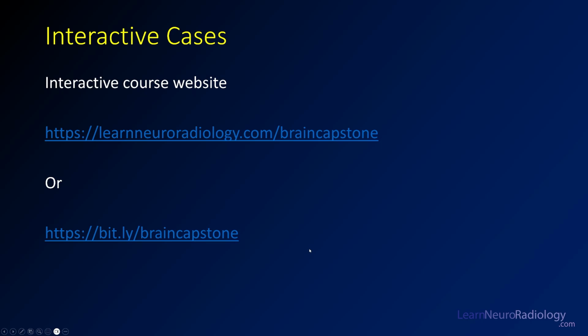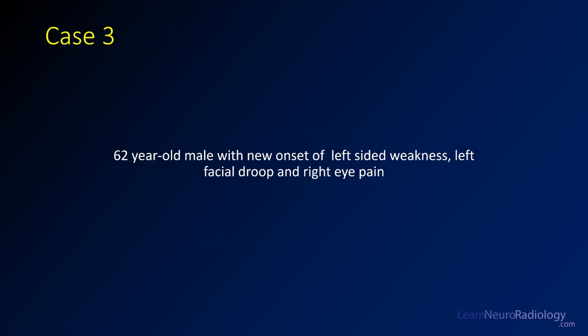So case 3 is a 62-year-old man with new onset left side weakness, left facial droop, and right eye pain. So let's just get to the images.